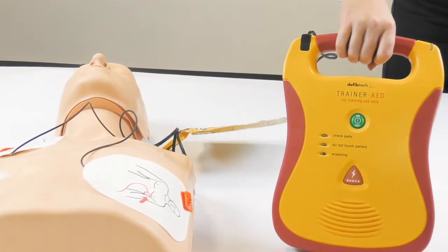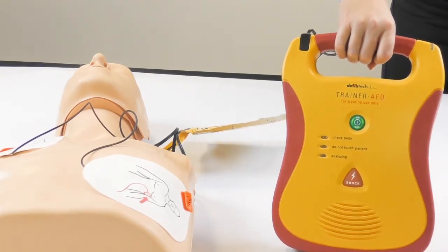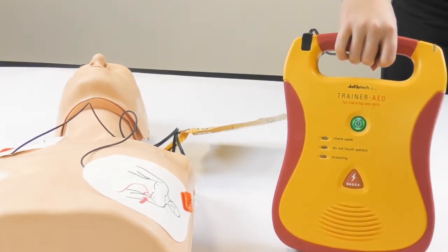Shock one delivered. It is safe to touch the patient. Begin CPR now.